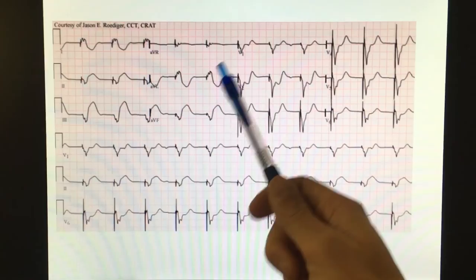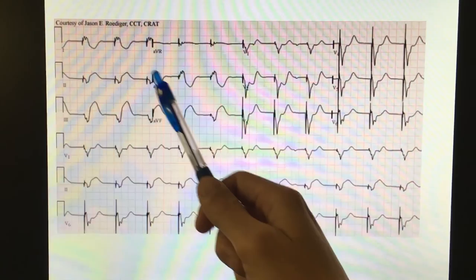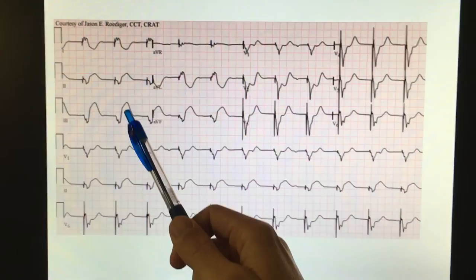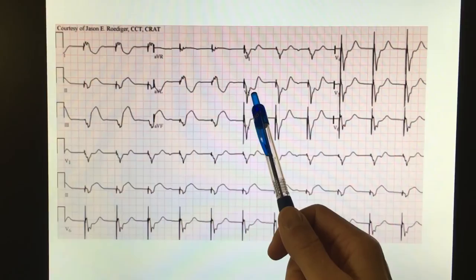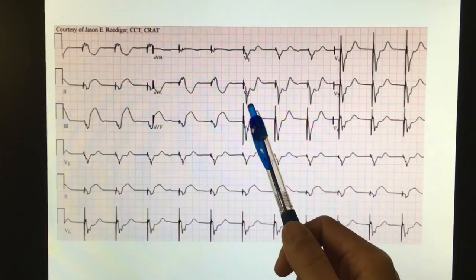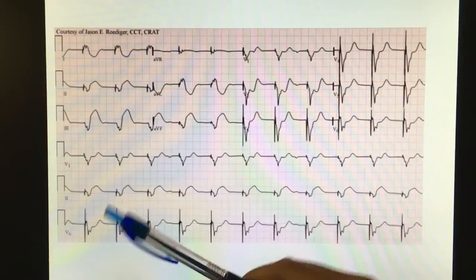Next one: this patient has a pacemaker, which definitely makes it look like a left bundle. You start reading for ischemia. Discordant — that looks okay. These are discordant; even though that looks big, it's just discordant. Then you get to the anterior leads and you say, that ST segment right there is going the same direction as the QRS. And that is enough to call this a STEMI-looking EKG. This was a STEMI in a patient with a pacer.